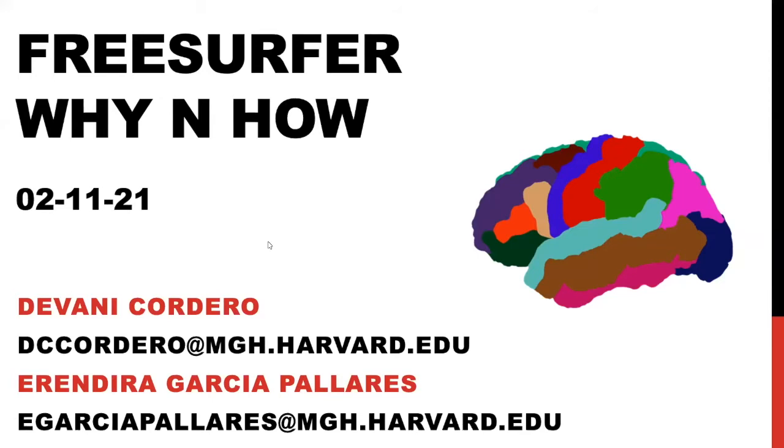All right, thank you so much for organizing this and putting it all together. My name is Dev, and this is Ren, and we both work for the Laboratory for Computational Neuroimaging, otherwise known as the FreeSurfer Lab. Some people call it the Bruce Fischl Lab, whatever it is, we work for it. Our lab developed the software FreeSurfer that can take MRI images and do all kinds of fun analyses on it. So I'll be giving an overview of that.